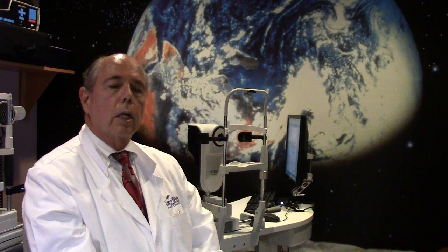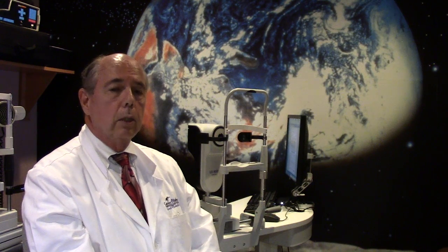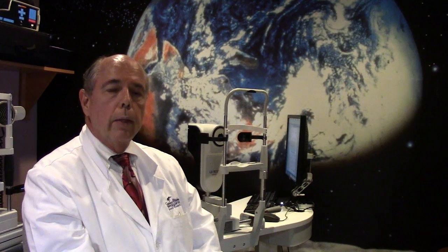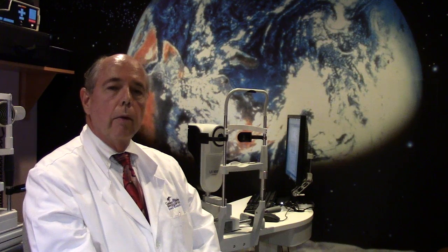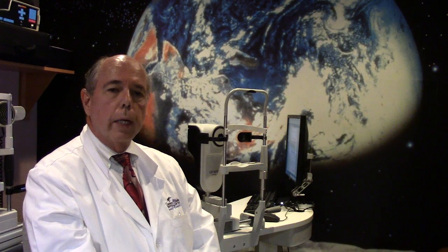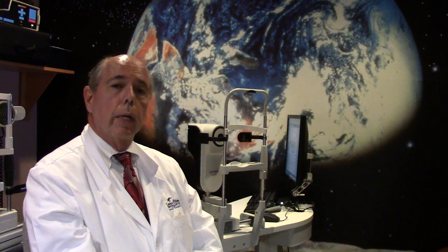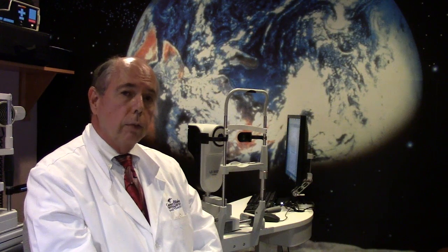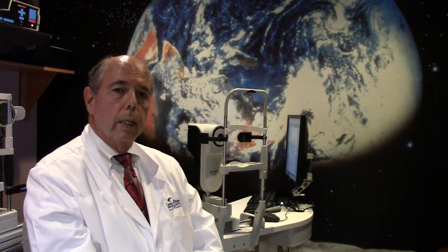And also the companies that make these intraocular lenses that are toric or astigmatism lenses have a formula as well that we then go to their website put in all the measurements we've got on the patient and then it prints out a strength of toric intraocular lenses that we can place in this person's eye to correct their astigmatism and vision whether they're nearsighted or farsighted. And so that's what we did in this case.